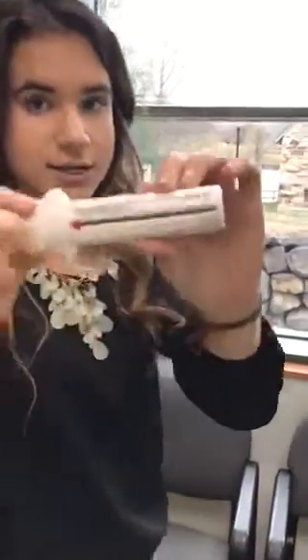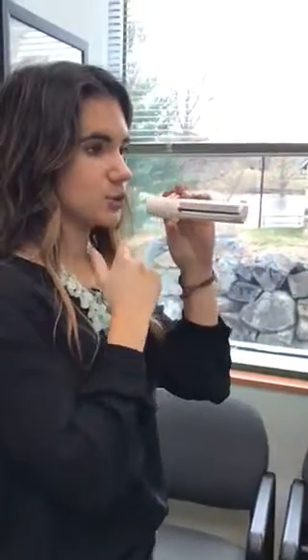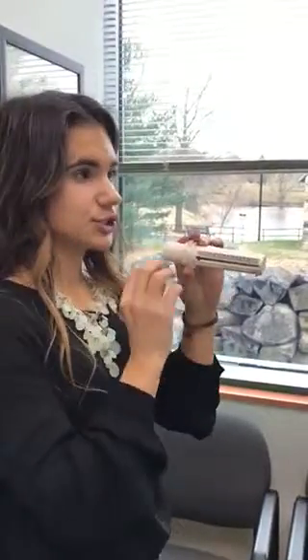So it looks like this, and you see that there is a scale on it. And you're going to do it twice, so you want to put your mouth around it, kind of like a whistle. You want to make sure it's sealed. And you're going to take a deep breath in and then quickly blow out as hard as you can. And you just need to do it that one time, and this thing will shoot based off how you're exhaling.